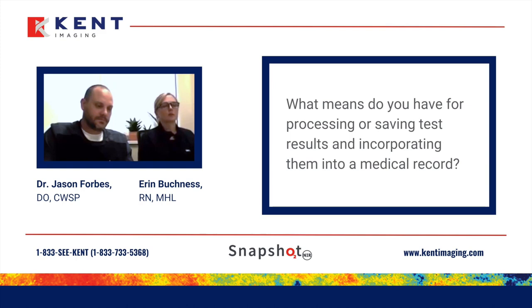For the vascular surgeons to see them a little bit more quickly and efficiently, we load those pictures into Epic. That's our home EMR, so they can reference them without having to find them within our progress notes. So they all easily upload and coordinate into any EMR system that you have, the pictures of what you really care about. And then for the interpretation part, I have templates built for the positive, negative, and then can add in the specifics for each patient on what those numbers are and what we want to do.